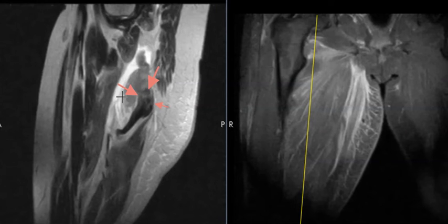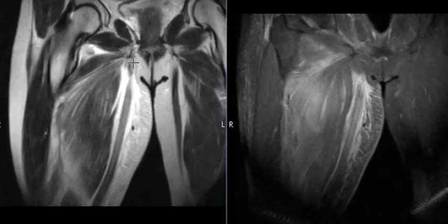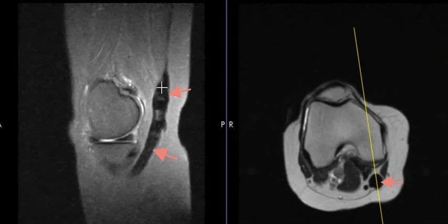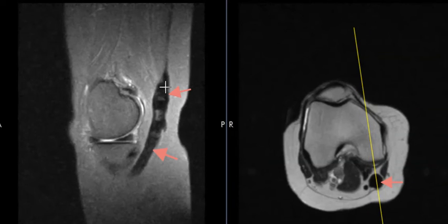And now we're going to look at the distal gracilis. Again, this is that gracilis coming off here, off the middle. Here's the origin. It's coming down, down, down. And now this other patient I had today had this, quite an abnormal gracilis tendon. So the muscle comes down here, and here's the tendon.